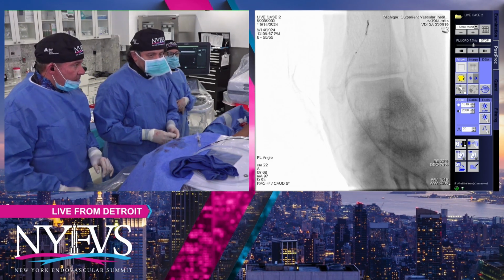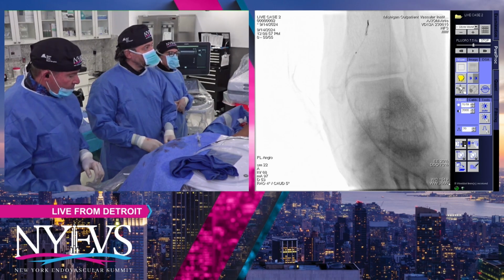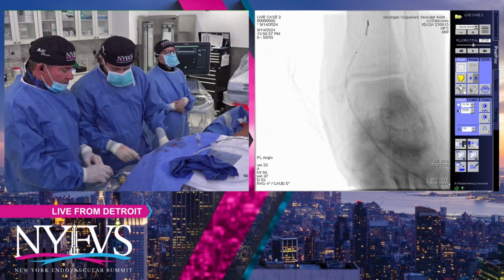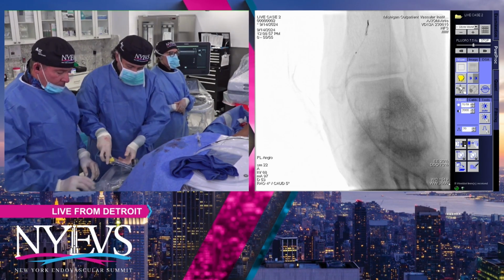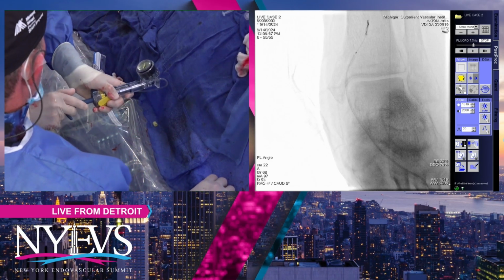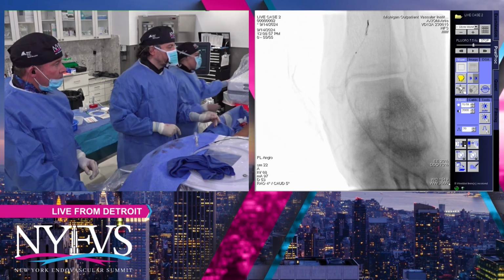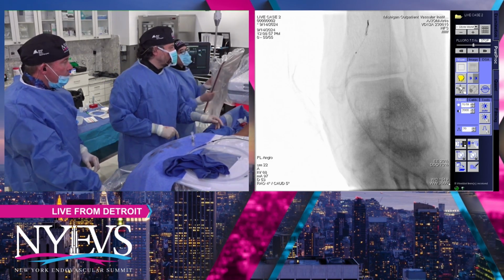It would be interesting at this point, prior to attacking the foot, if we really use the acceleration times to see pre and post, because if you have an improvement, maybe there's a threshold to come, because you could always come back, right? I mean, ultimately, if you have an improvement, you walk away. If it doesn't heal, maybe it's not as much as you need, but why venture on? Why take that chance?